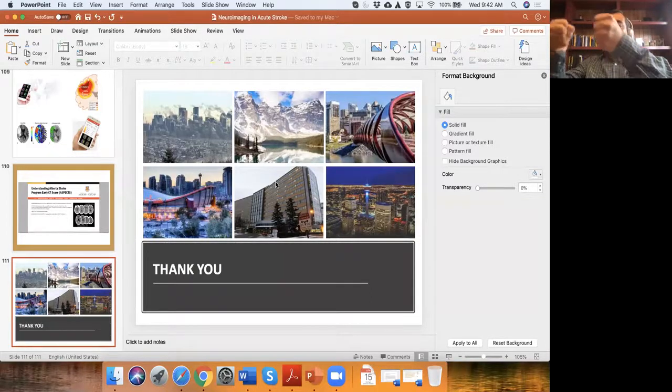Whereas when you do multi-phase, because you now have serial imaging, you can see the second and the third phase, and you'll see the contrast coming up in the 90% occlusion. So you will be able to differentiate between a near occlusion and a complete occlusion using multi-phase CTA. So those are things that you could do using CT angiograms.